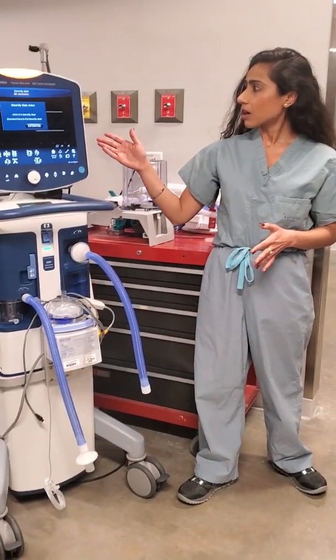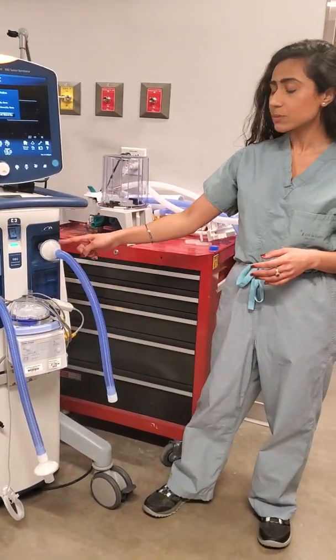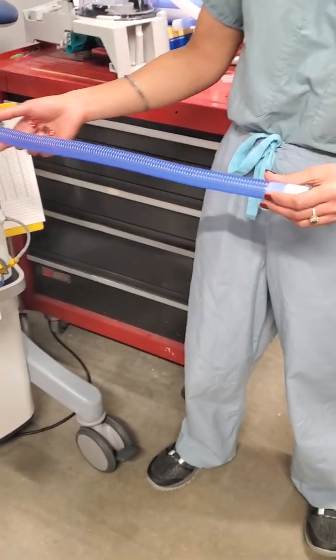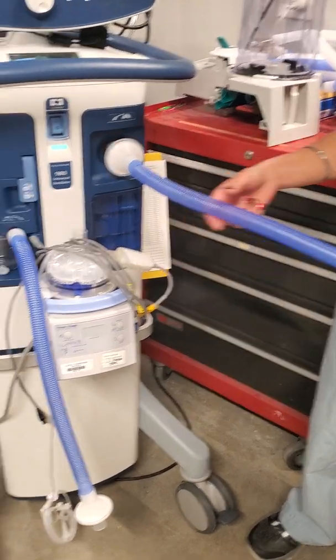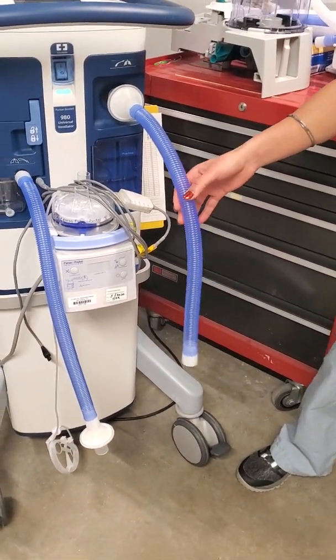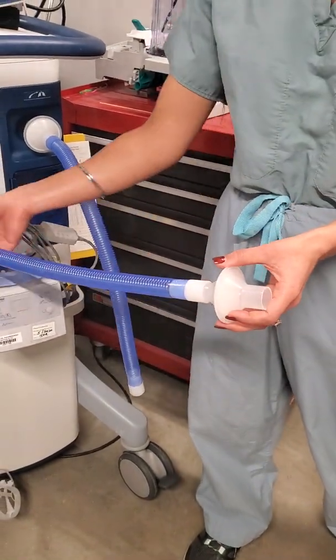This is our COVID Puritan Bennett 980 series — inspiratory limb, expiratory limb. You can see I have attached extra connection tubing on both sides to increase the length of the circuit so we can reach out to multiple patients. I've also attached an extra HEPA filter at the expiratory limb.